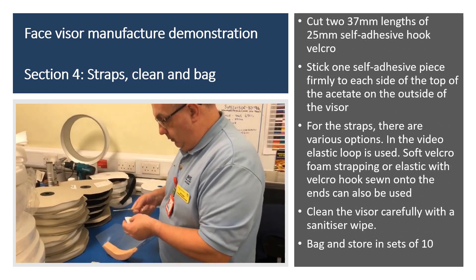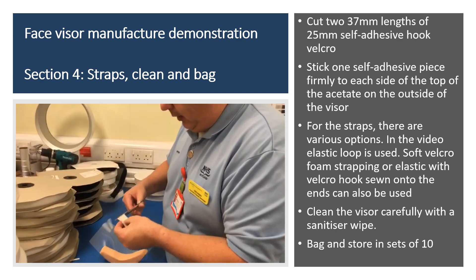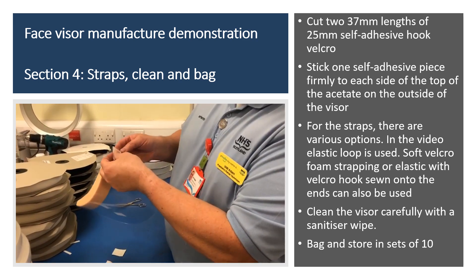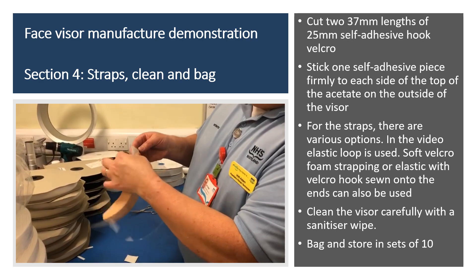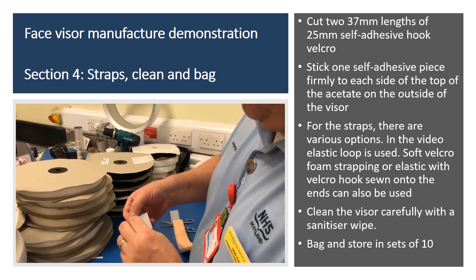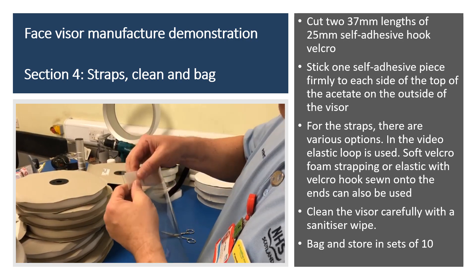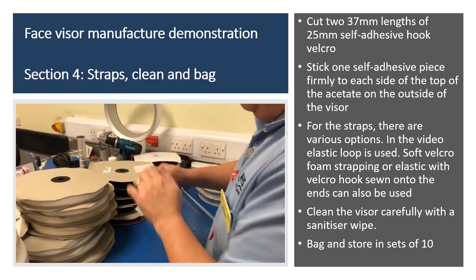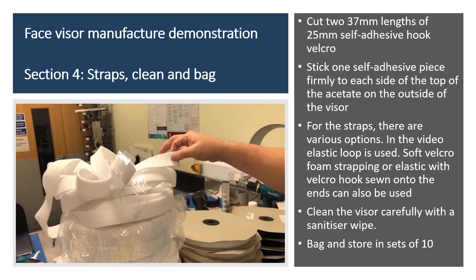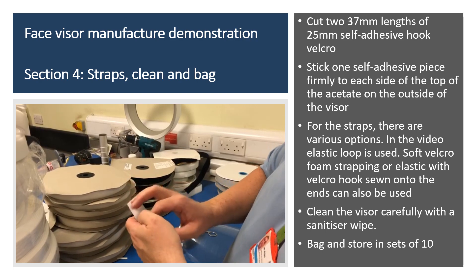So that was cutting and sticking. This last section is straps, clean and bag. Just take a small piece of self-adhesive hook Velcro, probably about an inch and a half, and stick it just a little bit back from the edge — push that right down. Likewise on the other side. For the straps, we've got various options. We're going to use the elastic just now, but we can use the foam padding. We've got quite a lot of elastic so we should be okay, but if not we might need to use a smaller piece of elastic just stitched on.